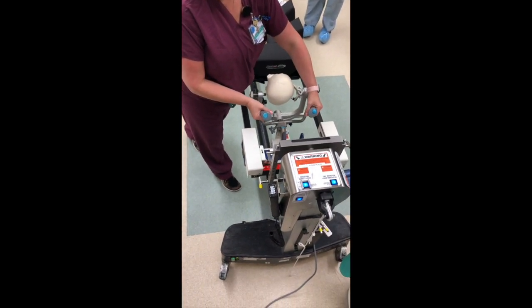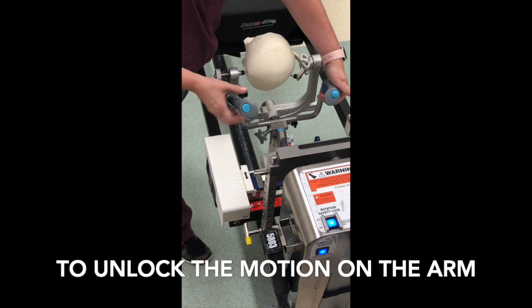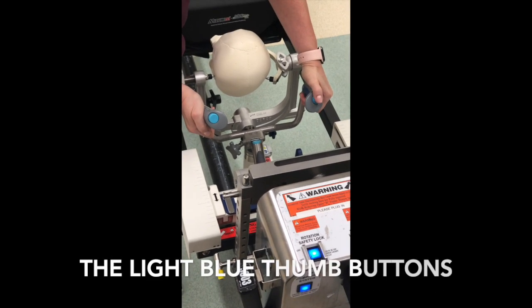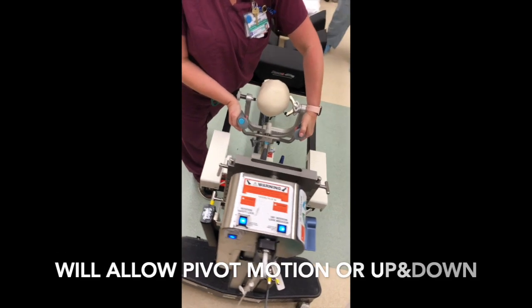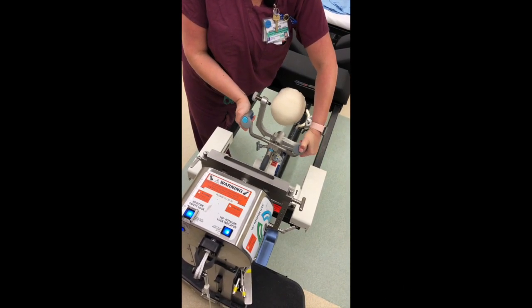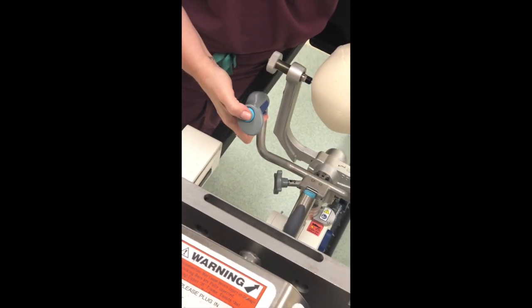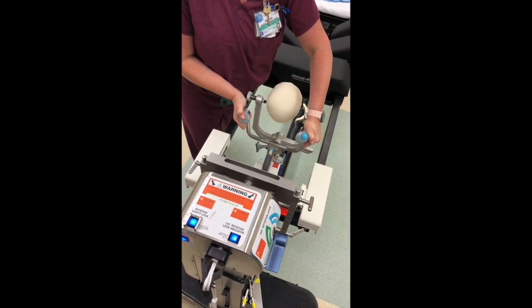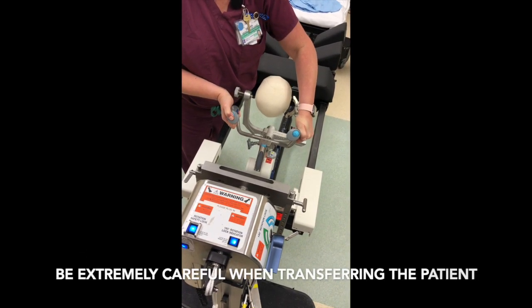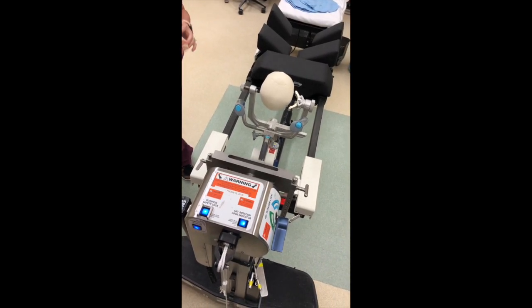The surgeon will use the handles to position the patient's head. The blue buttons pressed in at the same time will unlock it. The lighter blue button at the top of the handle on the patient's left will allow the head to be moved side to side, left to right. The blue button on the top of the right handle will allow you to move the patient's head up and down. Pressing it slightly caused it to jerk, so this must be done very carefully — the surgeon will operate it or direct staff to assist.